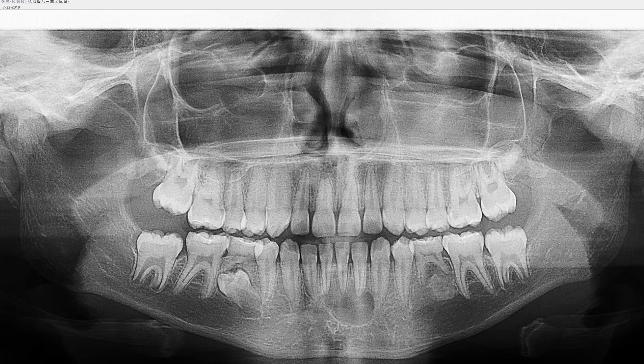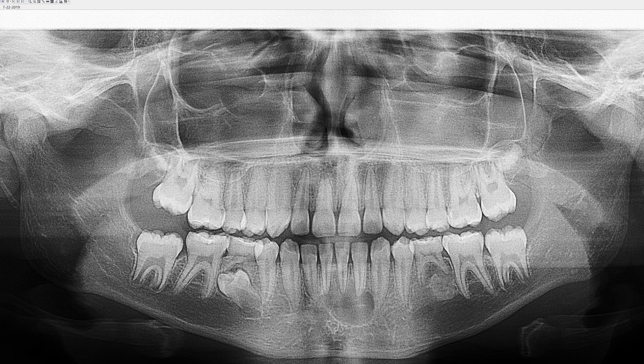Hello everyone. Today you're looking at a panoramic radiograph of a 12-year-old patient. As you can see, there's a lot going on in the mandible and we're going to identify three interesting areas specifically and re-examine them in a CBCT scan.